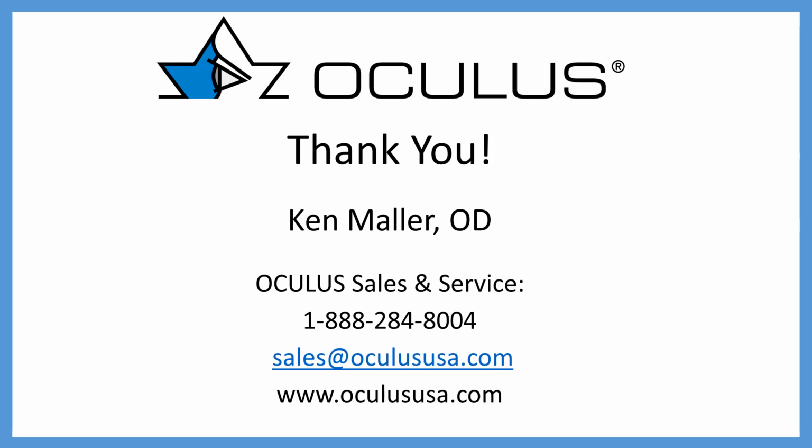Now the last 2 scans, the superior and the inferior, can be brutal in that getting the lid out of the way really can be very, very challenging. Obviously, you really want to take your time to get those scans done well, but the single most sage advice I can give, after trying virtually all types of approaches single-handedly, because I do the scans myself since I rely so heavily on the data, is that enlisting the help of 2 more hands, someone who can help you do the scans at the same time, is an absolute must. There is no way that this data can be captured by a single person.